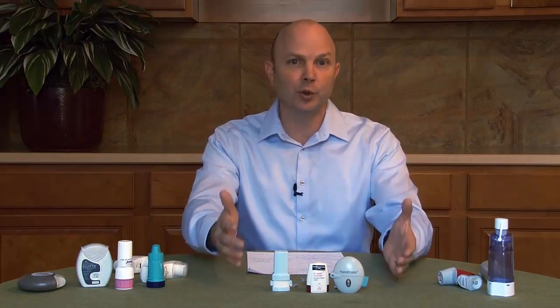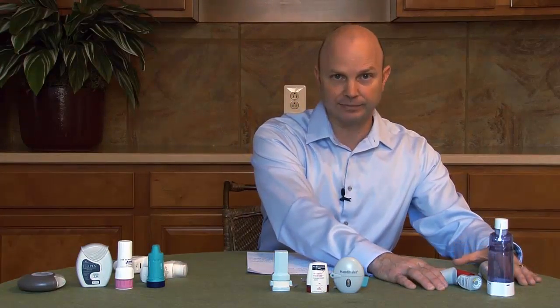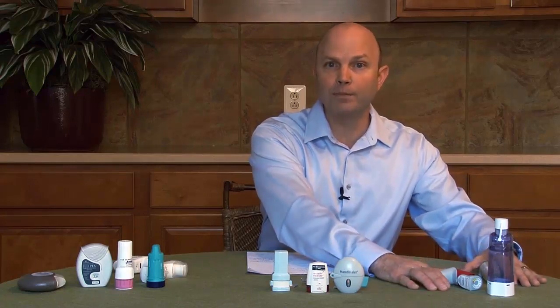What we're going to talk about is teaching you how to use each and every one of these inhaler devices and the specific steps used in order to inhale the medicines into your lungs. In general, there are 3 different types of inhaler devices. We have our pressurized MDIs. This is a liquid form of medicine. We have our dry powdered inhalers. This comes in a single dose dry powder inhaler and a multiple dose dry powdered inhaler.